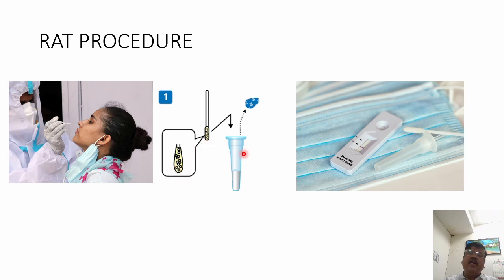And there is a cuvette given. It will be closed; we have to open it and put the swab in, so all the antigen will get dissolved in that. It will get disrupted, and of this solution, 4 drops are added in this slot. Slowly we see, by the immunochromatographic method, there will be percolation, a spread of that solution by capillary action.